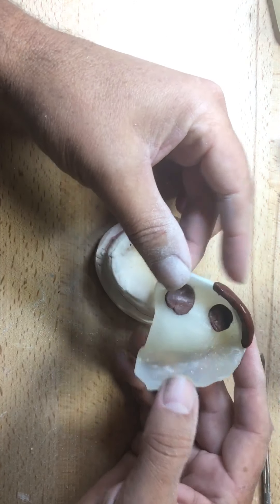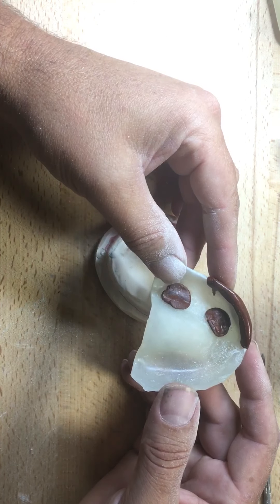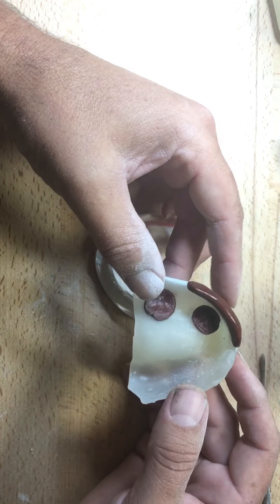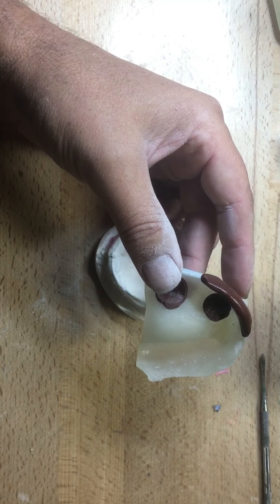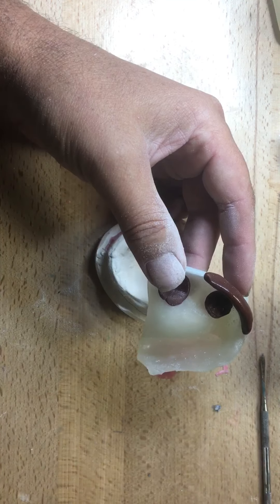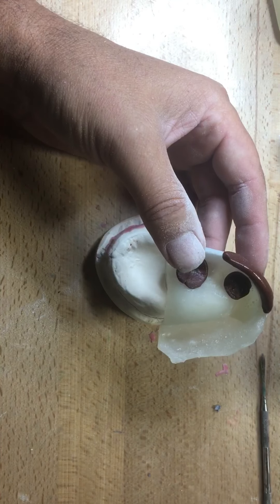So a little brief, a little quick, but we'll continue on with the lower one, and I'll use the base plate or the pink material. Thank you.